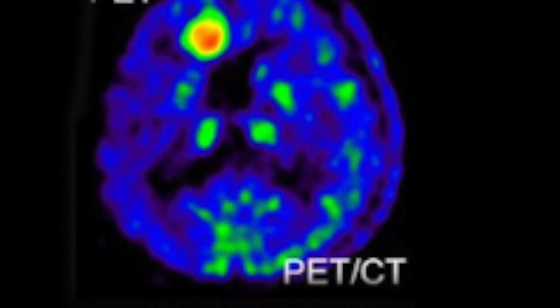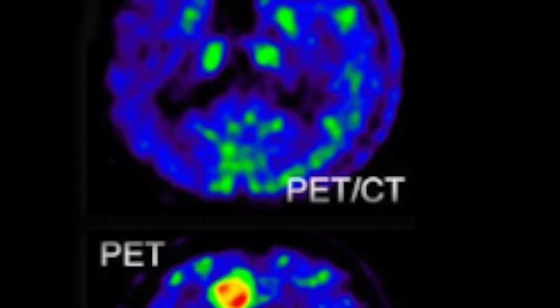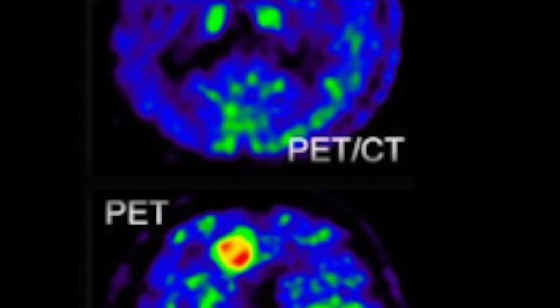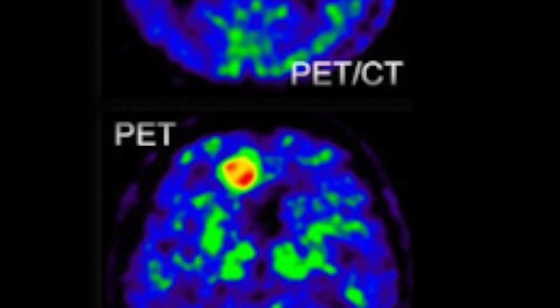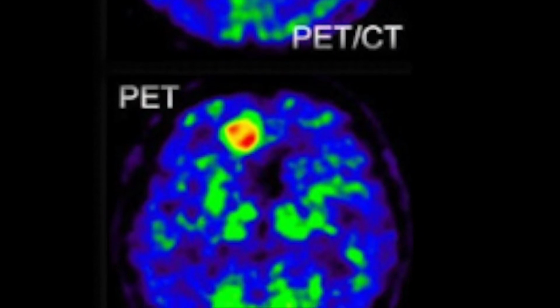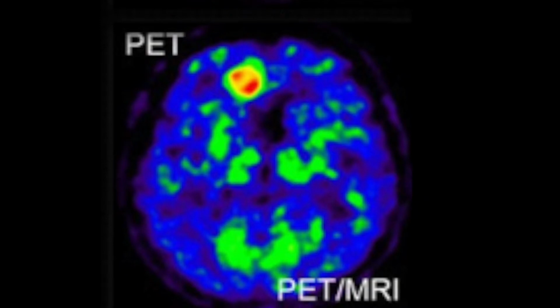This new high-resolution and high-sensitivity device produces much more detailed three-dimensional images than a regular PET scanner, as well as exposing the patient to less radiation. PET MRI provides high-quality images of tissue contrast with its MRI component, compared with the regular PET scanner, which focuses more on the structure of the image.